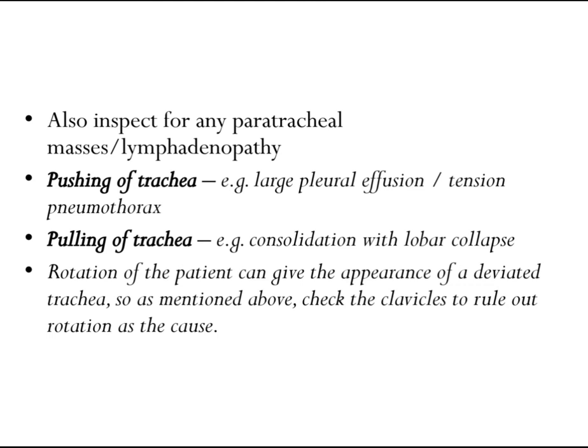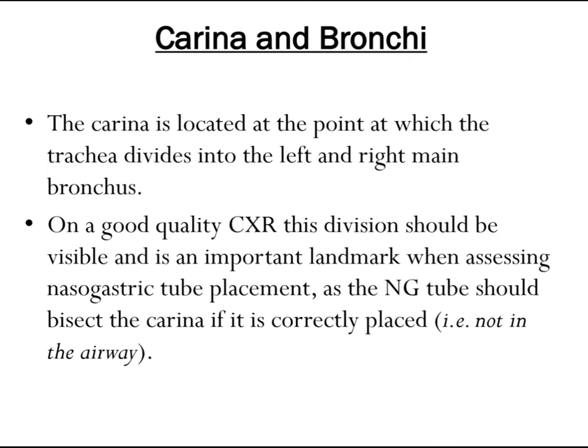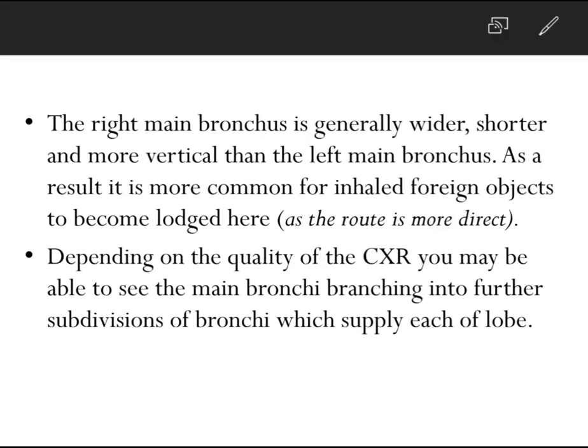Rotation of the patient can give the appearance of a deviated trachea, so check the clavicles to rule out rotation as the cause. The carina is located at the point at which the trachea divides into the left and right main bronchus. On a good quality chest x-ray this division should be visible and is an important landmark when assessing nasogastric tube placement, as the tube should bisect the carina if correctly placed. The right main bronchus is generally wider, shorter, and more vertical than the left.